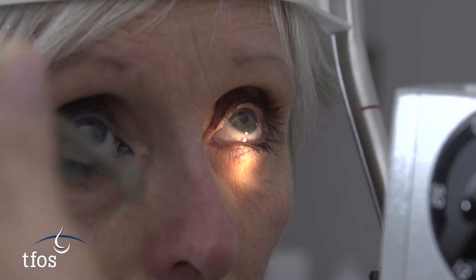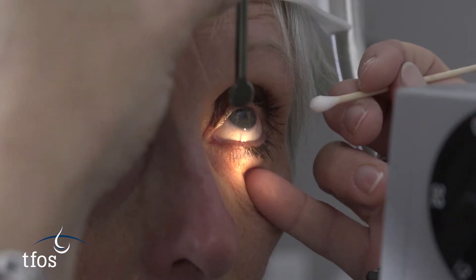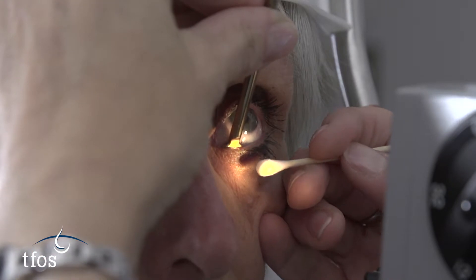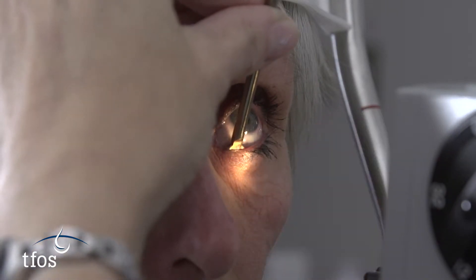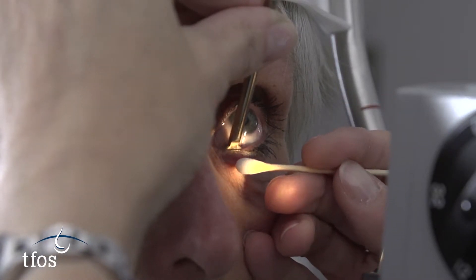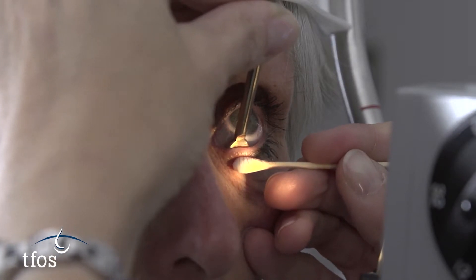The gland contents are expressed by compressing the glands and forcing the softened material towards the gland orifice. With the patient seated at the slit lamp, some practitioners apply firm digital pressure to the external eyelid. However, care should be taken not to place excessive pressure on the globe.